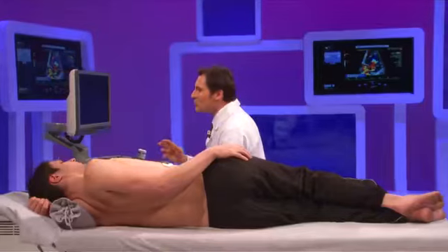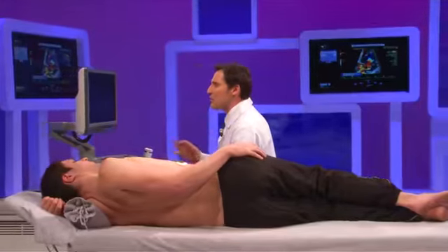And in this situation, 38 is almost close to 40. So we can say that we have moderate to severe mitral regurgitation according to the effective regurgitant orifice. And you know that the cutoff is 40. Below 40, between 20 and 40 is considered as moderate.